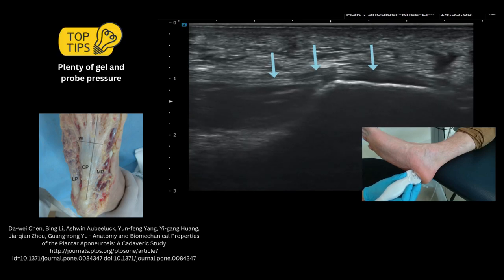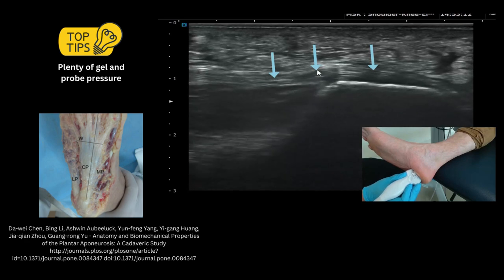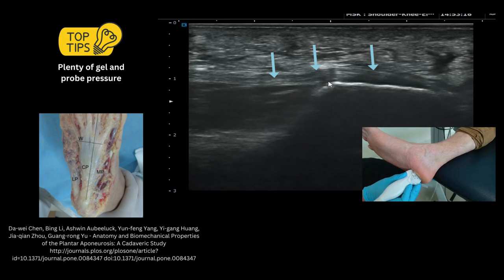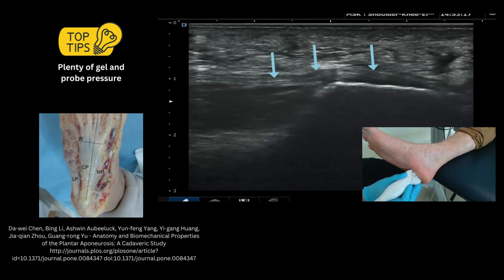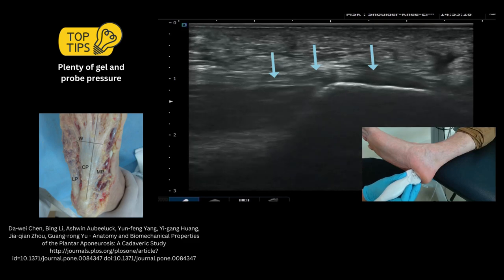Onto the calcaneus — you certainly need to be applying a fair bit of probe pressure here to get enough echoes down to these structures. Think about the region where you're going to measure for pathological change. Just to confirm, this is the calcaneus — this is the key landmark to look for when you're starting to scan this region.